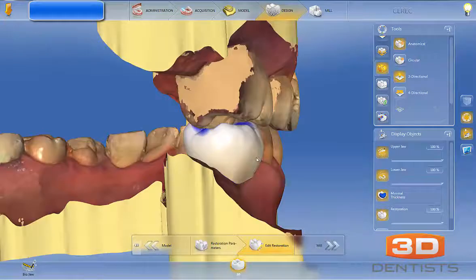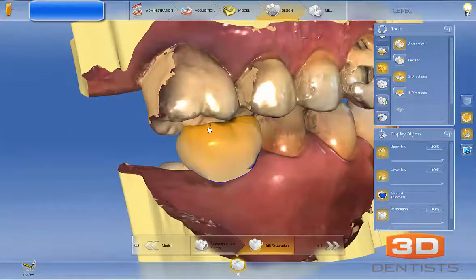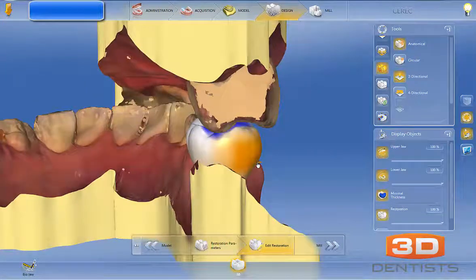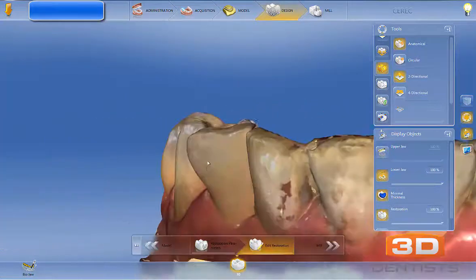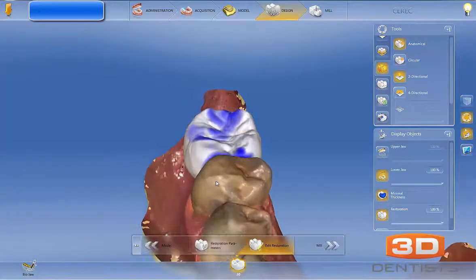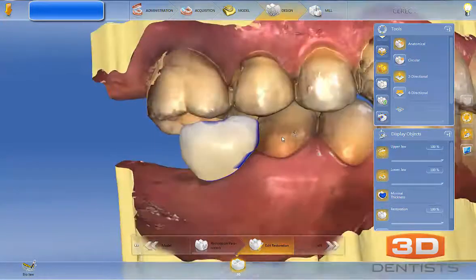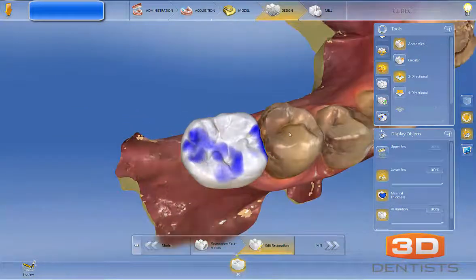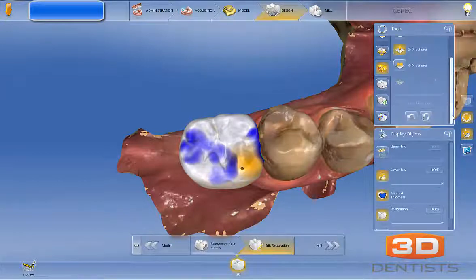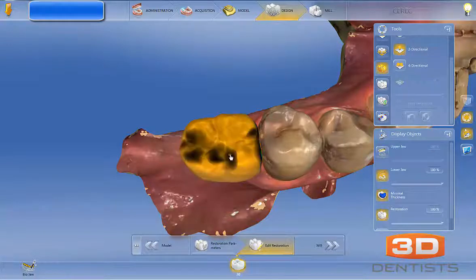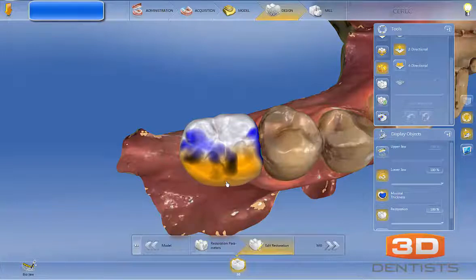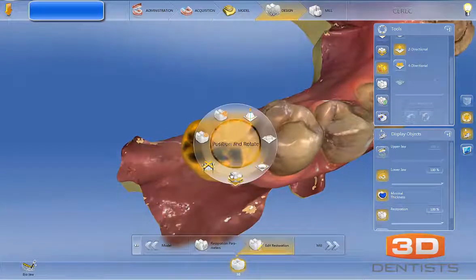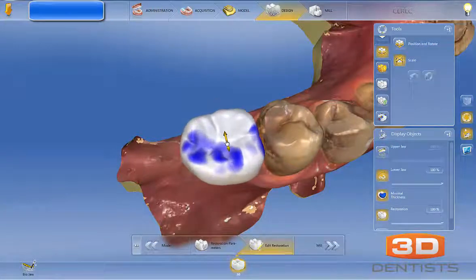The central groove is in the right spot, but the buccal width right here is not correct. This tooth should probably be about that wide, and then maybe a hair bit taller to get the occlusion correct. I used the anatomical shape tool to do this, and that's not bad, but the negative is that my central groove stays in the same spot and just the buccal cusp comes out — so the central groove is no longer in the right spot. When you have a tooth size discrepancy, the better way is to use your scale tool to make the tooth the proper size.